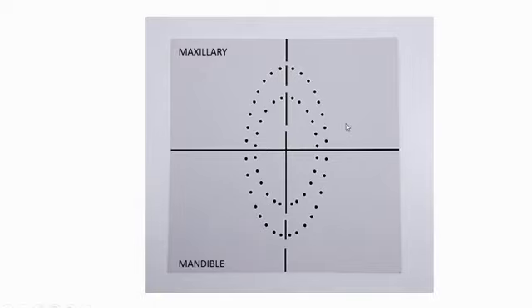Now moving on to the second component, it is the rubber dam punch and template. तो basically punch and template कैसे होता है? You can see a template. Now as you start with your rubber dam practice, it will be very easy to start to punch on a rubber dam sheet according to this template basically. ठीक है. इस टेम्पलेट का क्या फायदा होता है, इससे आपको पता चलता है which tooth number you are using, you can punch in that area.